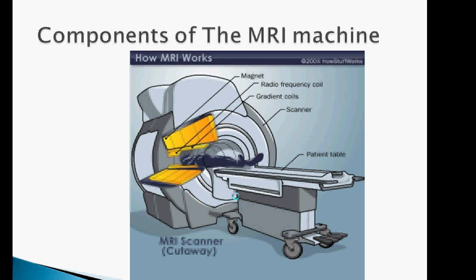It has no resistance to electricity and generates no heat, so there's no loss of energy when using it. The only thing is that in order for it to maintain these properties, it needs to be kept at negative 452 degrees Fahrenheit, and this is achieved by a refrigerating unit applying liquid helium to the magnet.